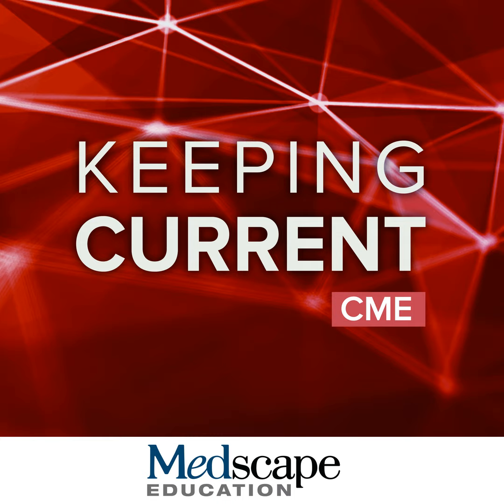So when you look at the table here, this lesion is less than 2 centimeters, has no APHE, and could be classified as LI-RADS 3. However, because of the hypointensity on the hepatobiliary phase, we classified this to be a LI-RADS 4 or probable HCC, pretty much like case number 2.